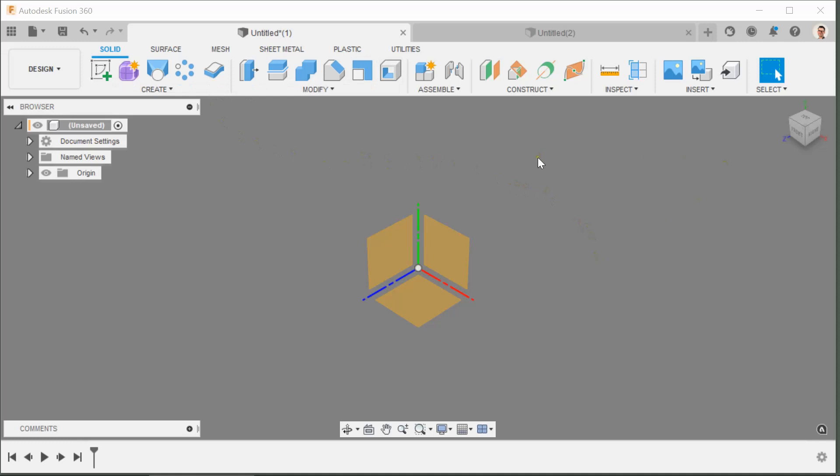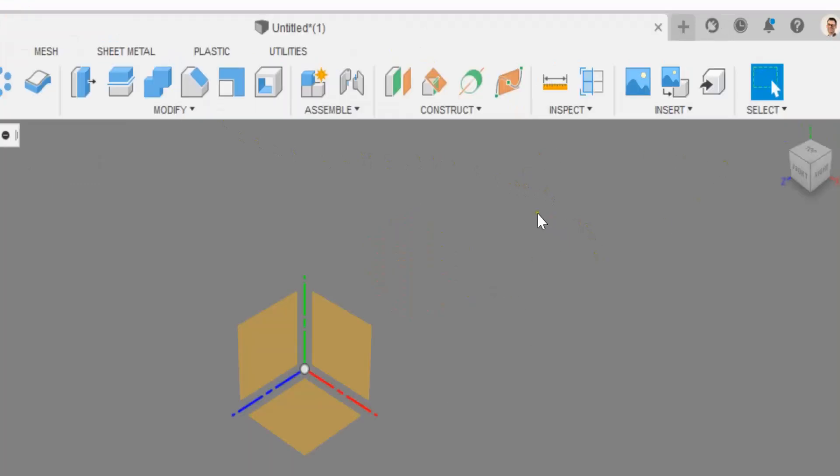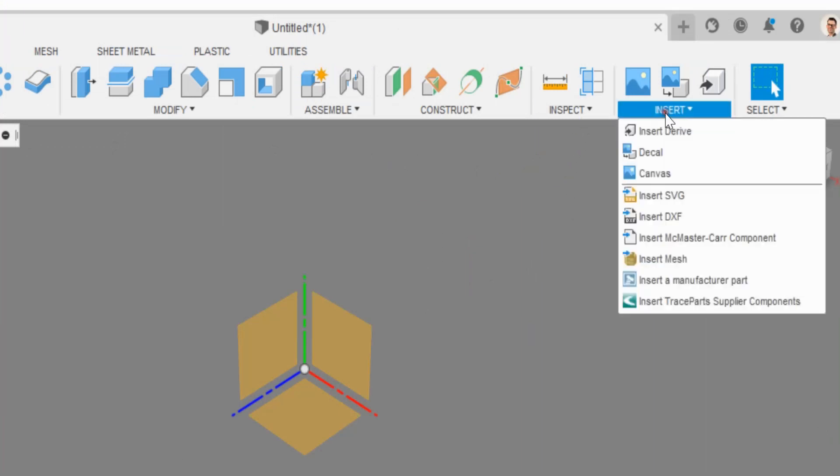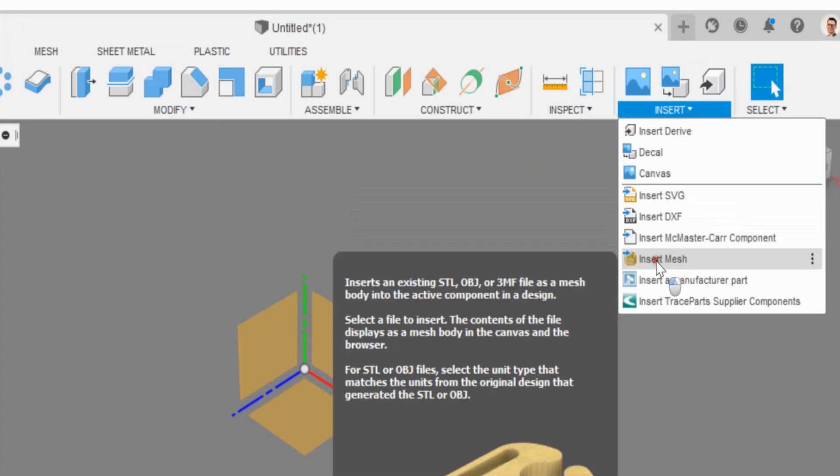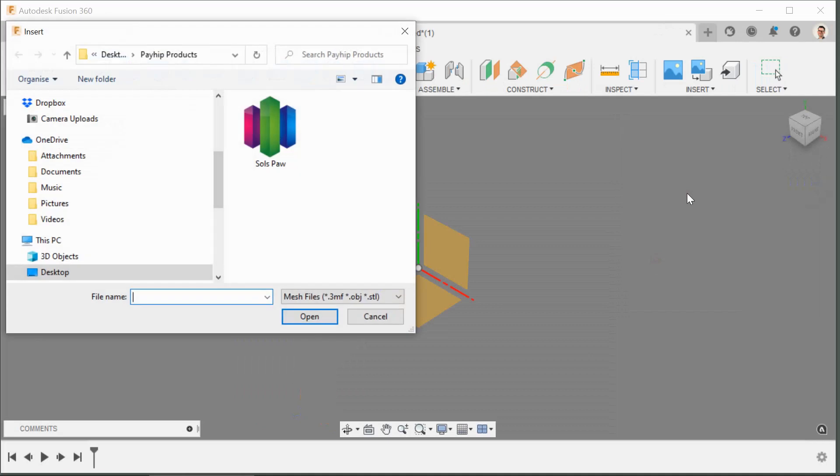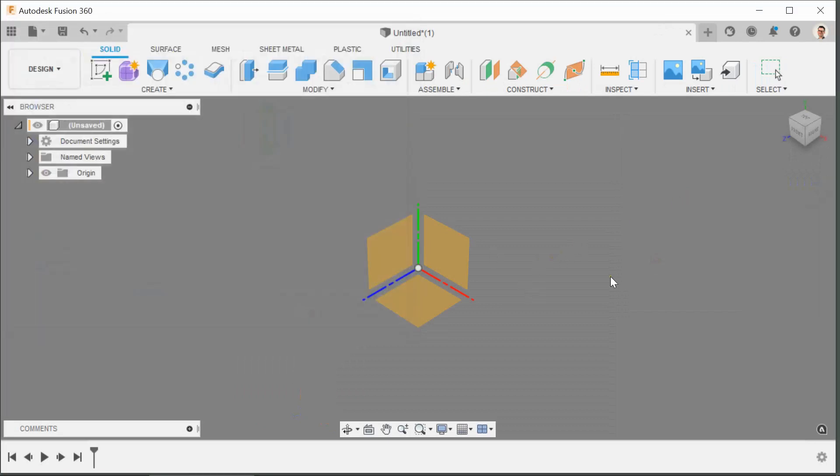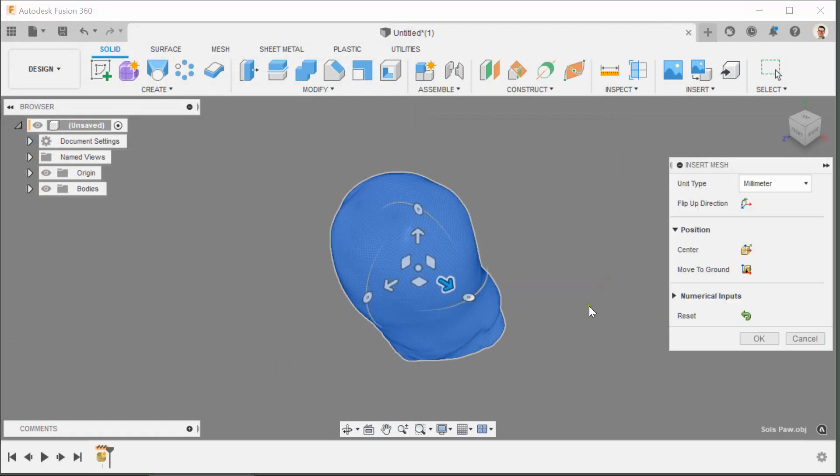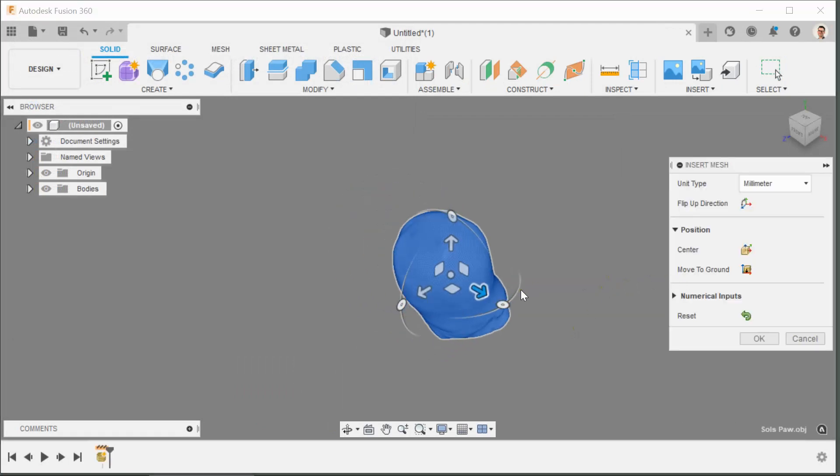So in a new file go over to Insert at the top drop down menu and insert mesh. Having downloaded Sol's Paw you should now be able to bring it into Fusion. That file is already in the correct format, you don't need to convert it or do anything with it, it's an OBJ quad.